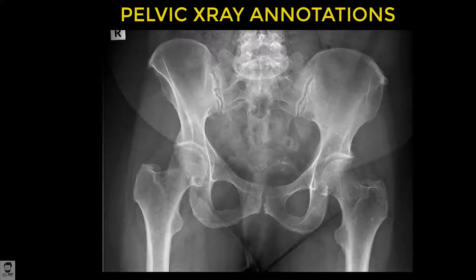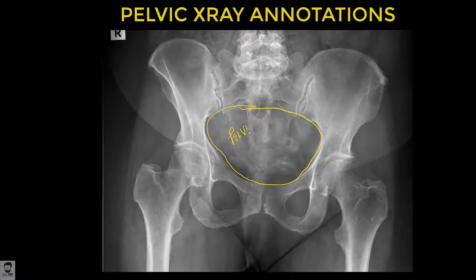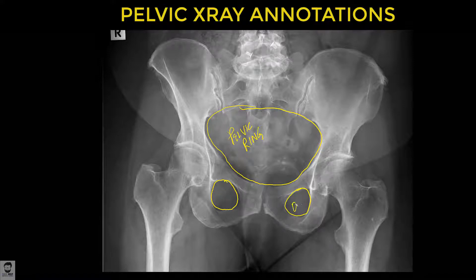The first thing to identify is the pelvic rings — this here is the main pelvic ring. Next, we identify the two obturator foramina: this is one obturator foramen, and this is the second obturator foramen.